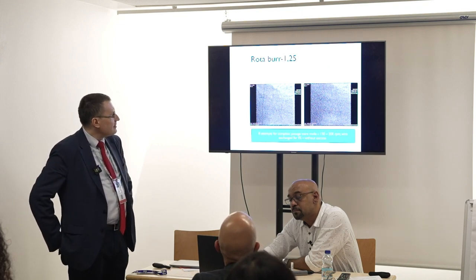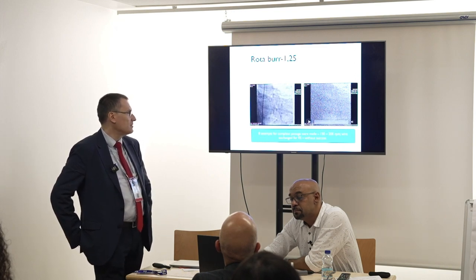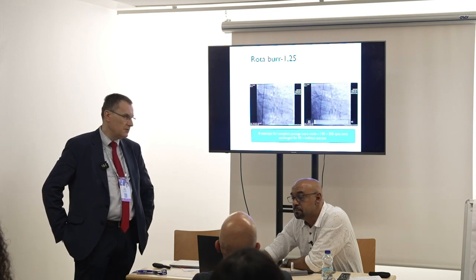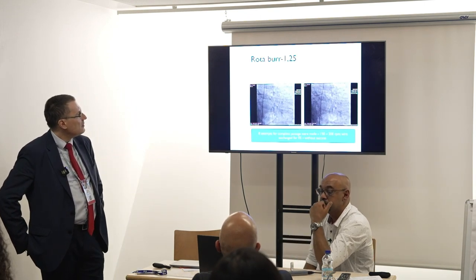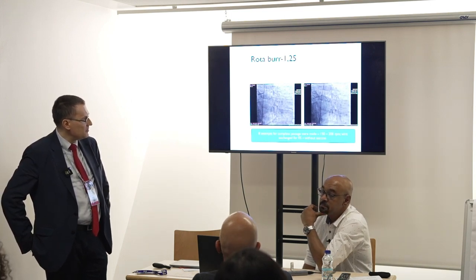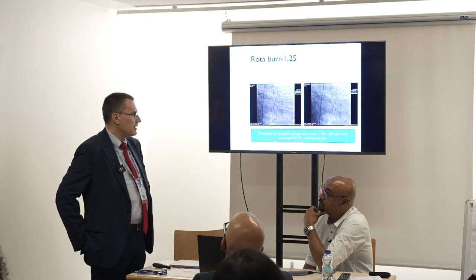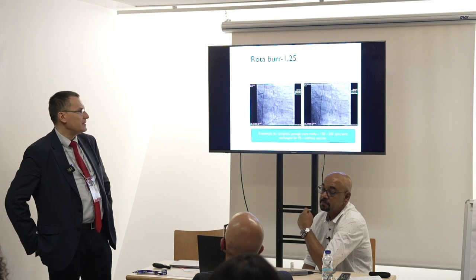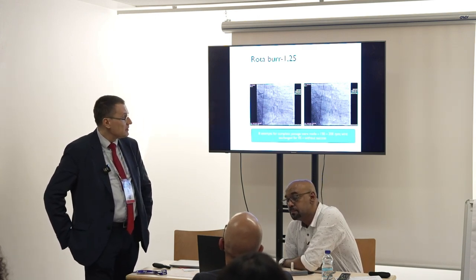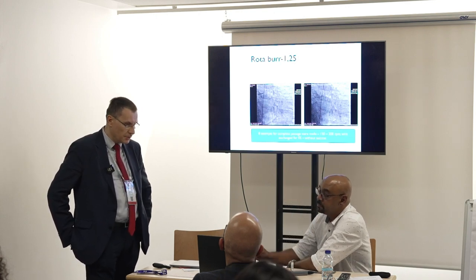So next, the saga continues with almost 30 minutes of trying to do rota, and it was not possible to cross more than the first 5 to 6 millimeters on this marginal branch. I exchanged the wire with extra support, increasing the burr rate up to 200, and it was just not possible to cross with the burr.